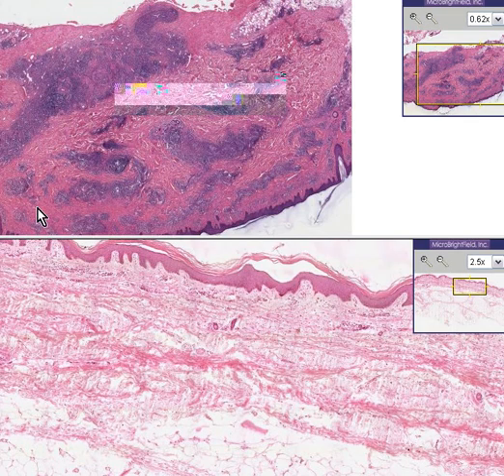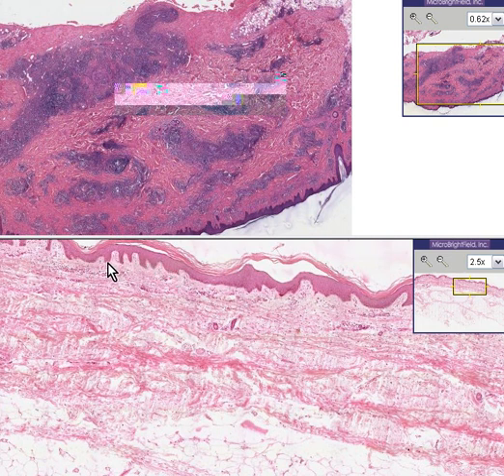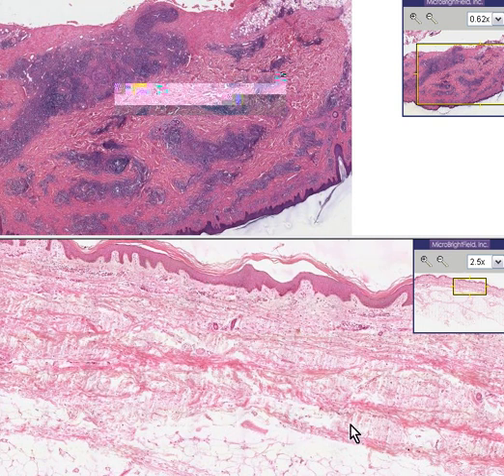Here's another case. On the bottom we could see normal skin. We could see a stratum corneum of the epidermis, a nice epidermal layer, and epidermal pegs. We could see the papillary dermis and a fairly nice uniform reticular dermis and subcutaneous fat.